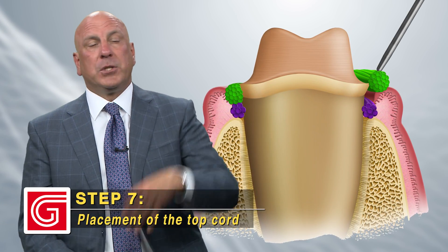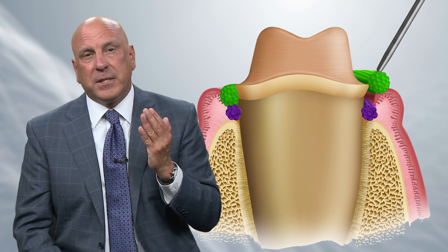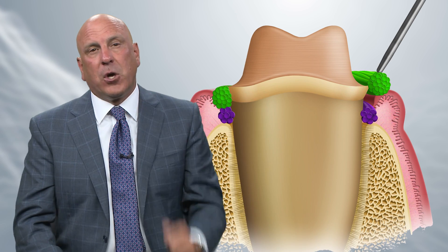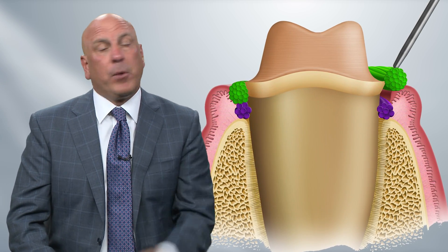Once we smooth off those angles, place the top cord. I put a size 2E cord as the top cord. Size 2 fits on maxillary anterior teeth and lower molars well, but sometimes won't fit on lower bicuspids and won't fit on lower anteriors. For lower anteriors, the top cord is probably a zero. On lower bicuspids, it's usually a double-zero with a size 1 on top. On molars, double-zero with a size 2 on top. On upper bicuspids, due to lack of attached gingiva, it's usually a double-zero that fits everywhere and then a zero or a one based on how thin and friable the tissue looks.